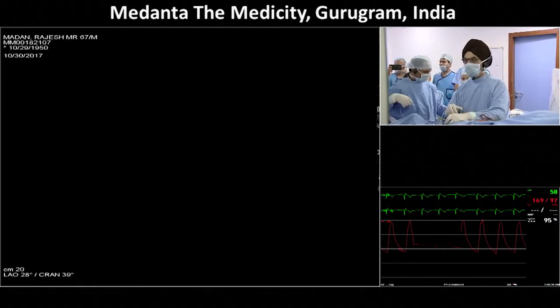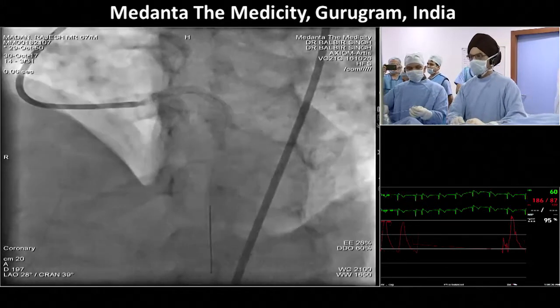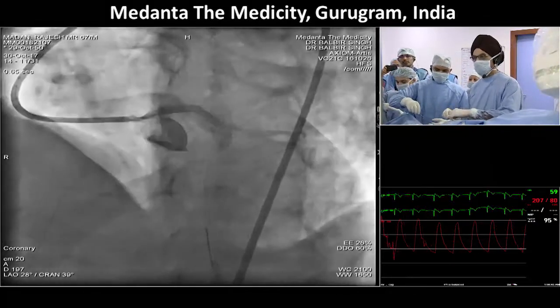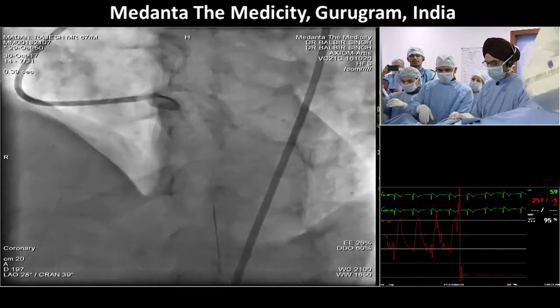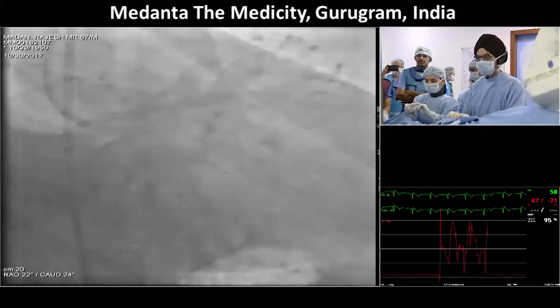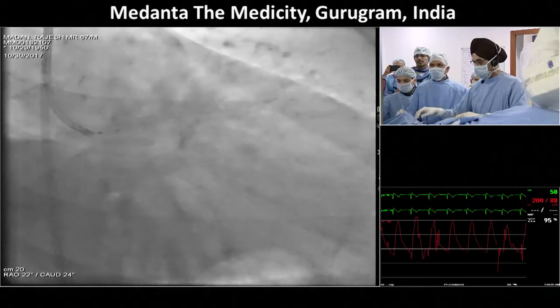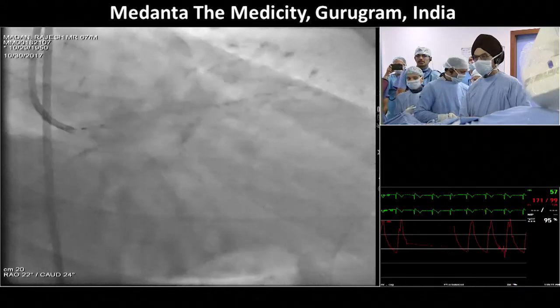Okay. So, would you be using two stents, a 5 millimeter stent for the left main and a smaller stent for the rest of the LAD, or are you happy with just using a long stent and then optimizing the size? It's probably cheaper to use one stent. That's an important point. It's cheaper. The only point about the one stent technique is that if you want to cover the ostium and you are going to do a proximal post-dilation with a 5 mm balloon, sometimes there is a little bit of shortening that you have to be aware of. So you probably have to protrude a little bit more with a 3.5 stent. I think most of the 3.5 platform can go up to 4.75 nowadays.